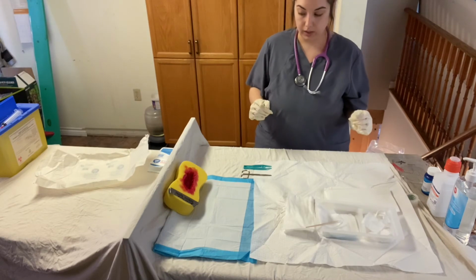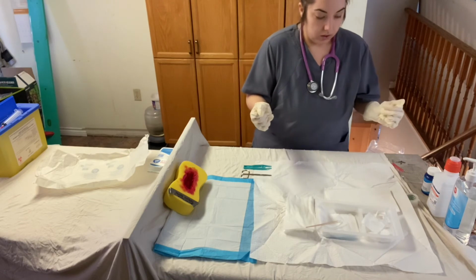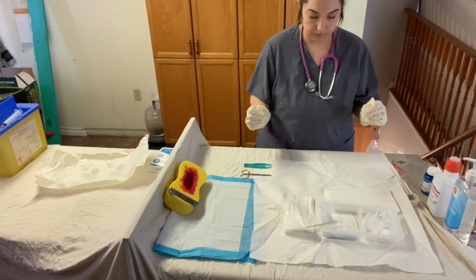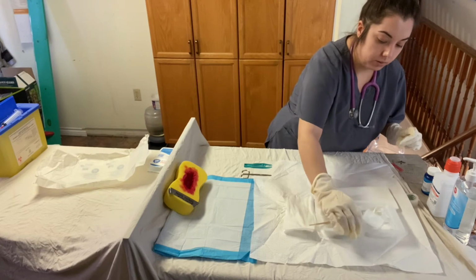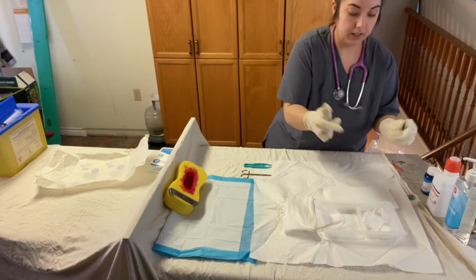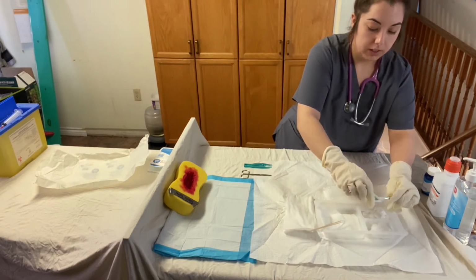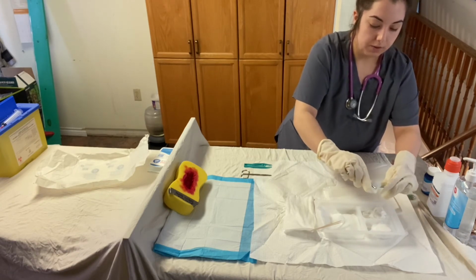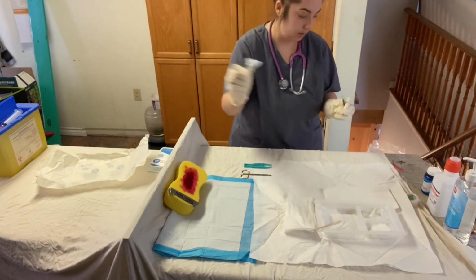And then I'm going to clean the wound. So I'm going to not touch my transfer forceps. I'm going to use my sterile tweezers, and I'm going to grab my 2x2s that are soaked in normal saline, and I'm going to just slowly wring them out a little bit. Perfect. Then I'm going to make sure I have a good grip on it, and I'm going to clean from cleanest to dirtiest from the middle down, and I'm going to dispose.